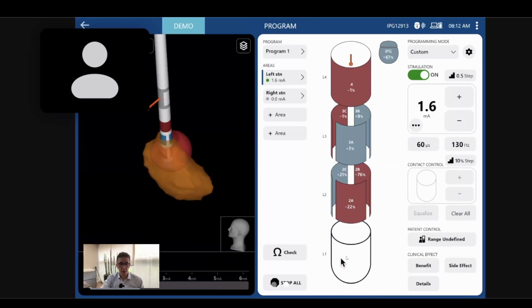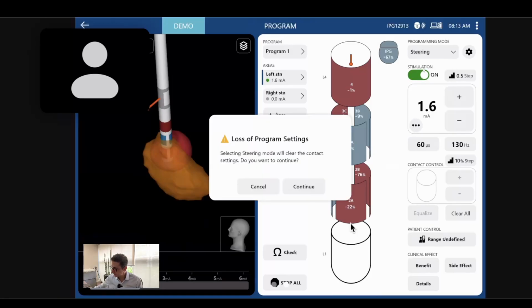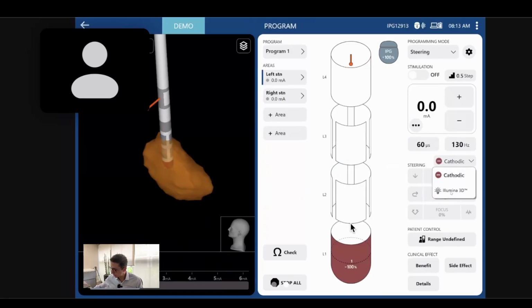And then you're going to start the stimulation using this. This is not Illumina anymore. This is your custom configuration that you got some idea from Illumina, but you did it by yourself, okay? So I do this too much in my patients. I get the idea from Illumina, then I shape it. And the other thing, just to finish here, that you can do, I'm going to return to Illumina quickly here.